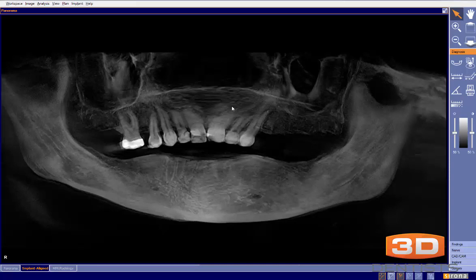The best way to do that is to visually show patients the different options. Looking at this patient, let's say we're going to maintain the teeth she has on the upper, but she'd like a new option for the lower and some option for the upper left. The truth is, we have multiple options — and that's part of the challenge.